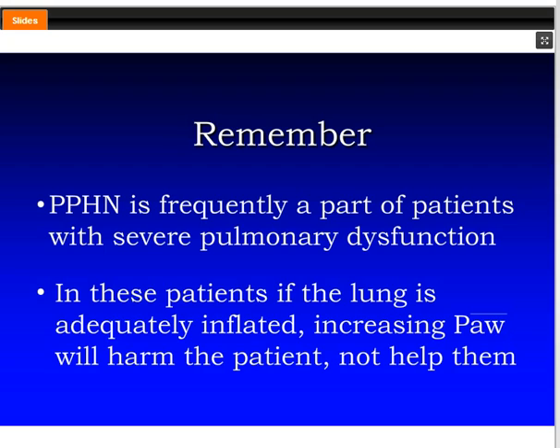If you put that side down, you can deliver a little less volume to that side, and you can allow that leak to heal. Remember, the reason babies get such severe PIE is because their leak is not at the saccule. Their leak is in one of the distal airways. And so what you're trying to do is minimize the peak to trough pressure in that area, which is allowing gas to escape. Putting that side down can be very beneficial for them.